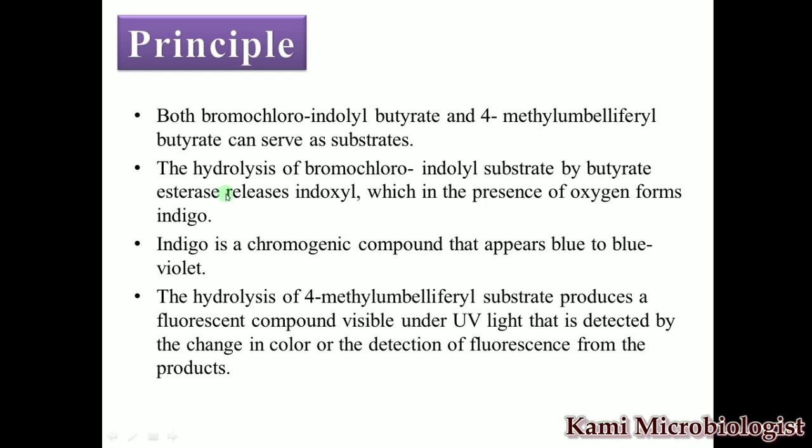This esterase hydrolyzes the bromochloroindole substrate. Once it is hydrolyzed, we get indoxyl, and due to the presence of oxygen we get indigo. Now what is indigo? Indigo is a color molecule, a chromogenic molecule, that appears blue to blue-violet in color.